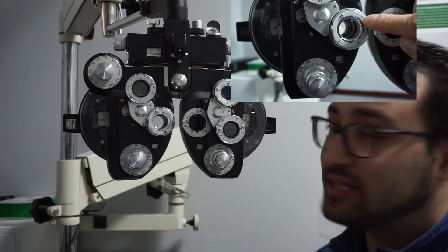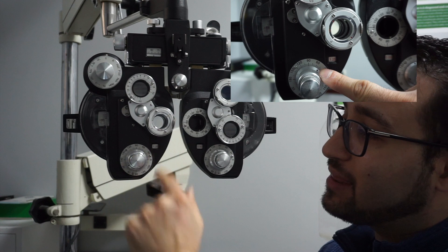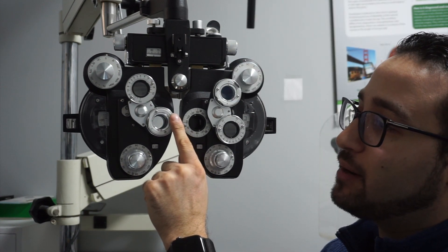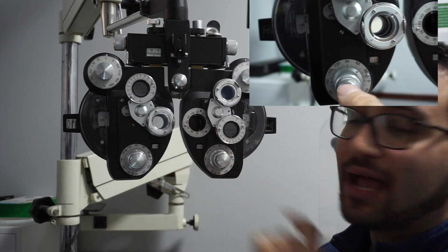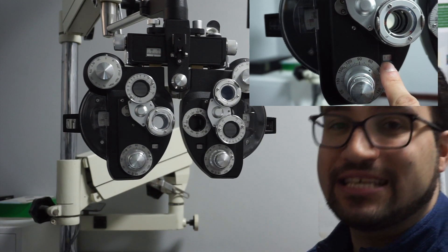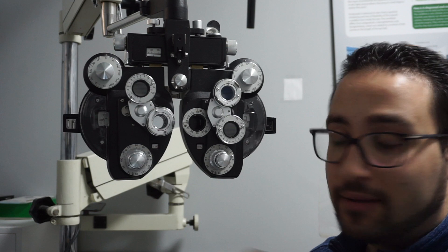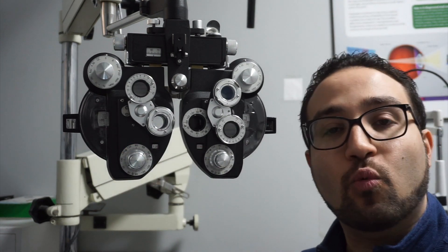Now we switch over to the power assessment of the astigmatism — that's where this P is right there, and it will be in line with your axis. You ask the patient again: option one or option two? If they pick option two aligned with the white, you decrease the amount of astigmatism. If they pick option two aligned with the red, you increase it — up until the point where they don't really notice a difference.